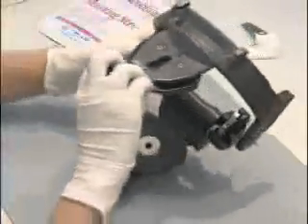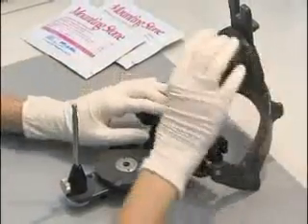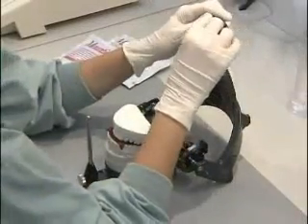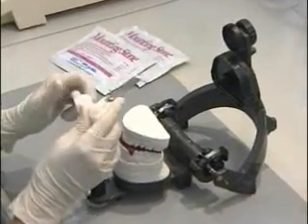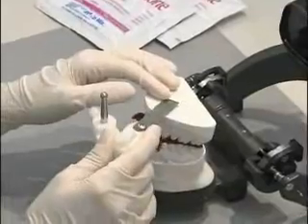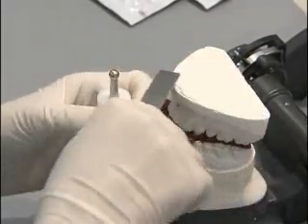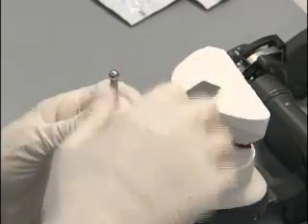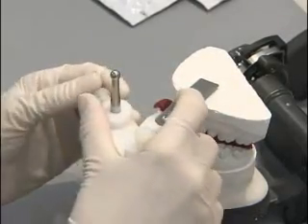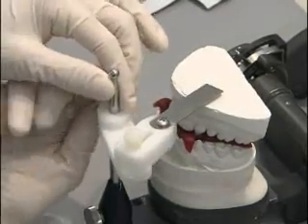Now we are going to demonstrate the technique for using the Panky AccuMount. We have flipped our articulator over and we are going to keep our pin on the upper member of the articulator. We will place our models on the upper member with the CR record interspersed between them. We are going to take the Panky AccuMount and slide it down the pin of the articulator, centering the metal portion over the CR record. We are trying to find the middle of the CR record so that when we press down we are putting the force equally over the record and not tilting the cast in any way.